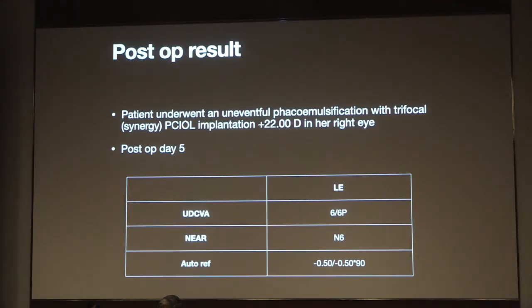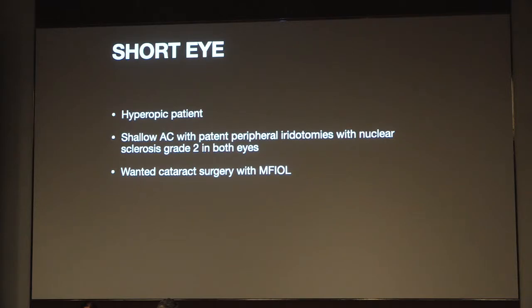And my patient went ahead with a successful trifocal Synergy IOL with a 22 diopter, and the post-op was 6/6 partial with an N6. The autoref showed that. All of you know that autoref is not very accurate as far as multifocal IOLs are concerned.